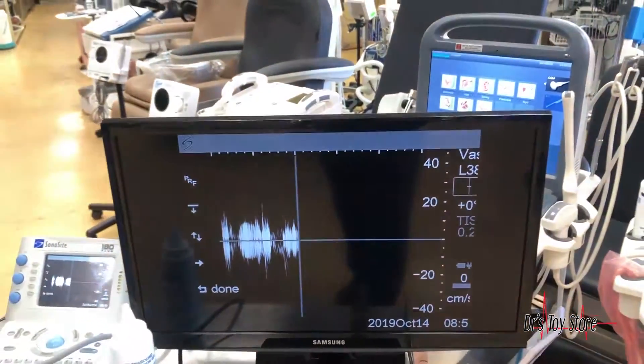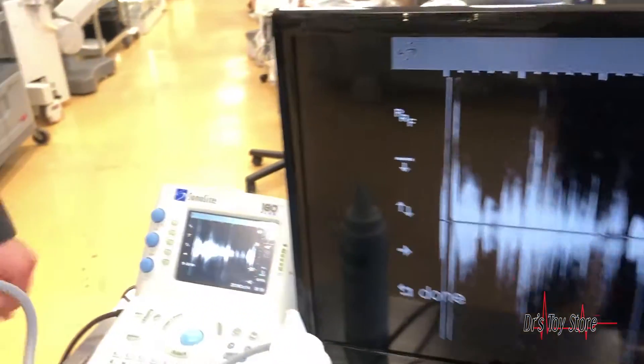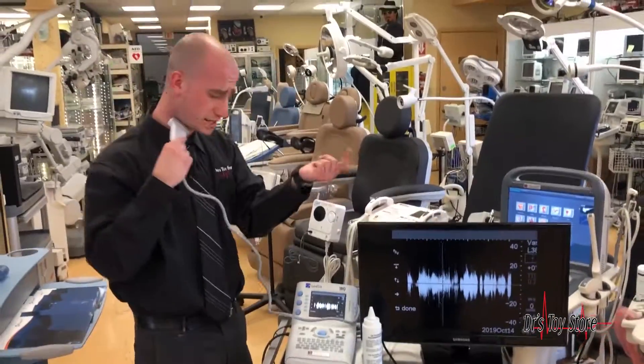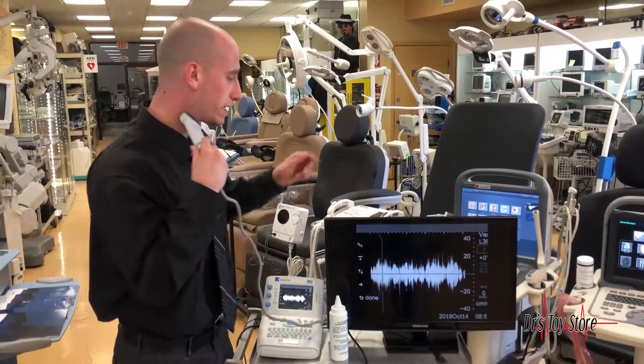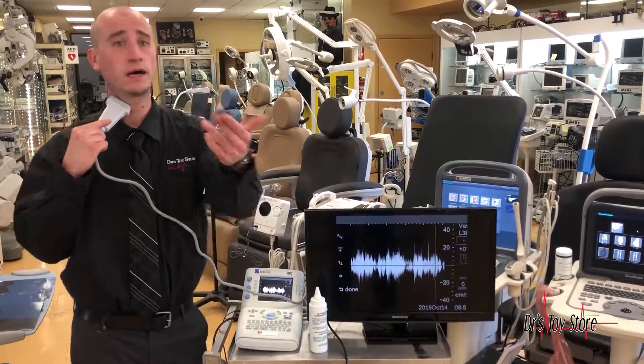And as you can hear, the Doppler sounds very, very nice. It's got your color, your Doppler, and it's extremely portable. All you need is a video-out to video-in cable that plugs right into the monitor — take it with you and you're good to go.